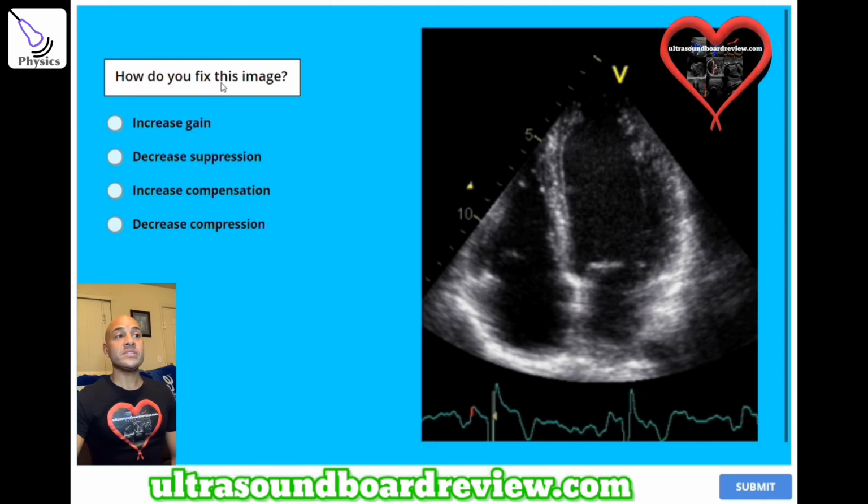Question 24. How do you fix this image? A, increase gain, B, decrease suppression, C, increase compensation, or D, decrease compression?